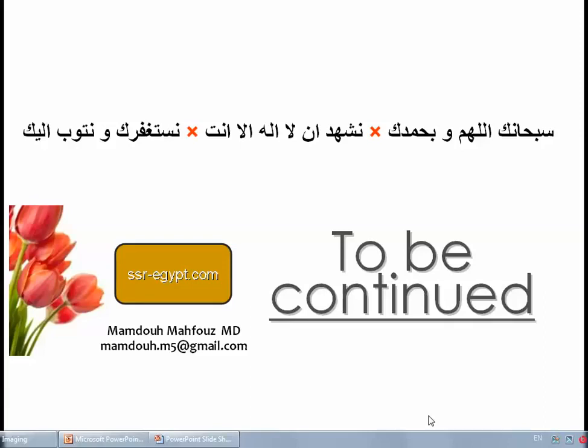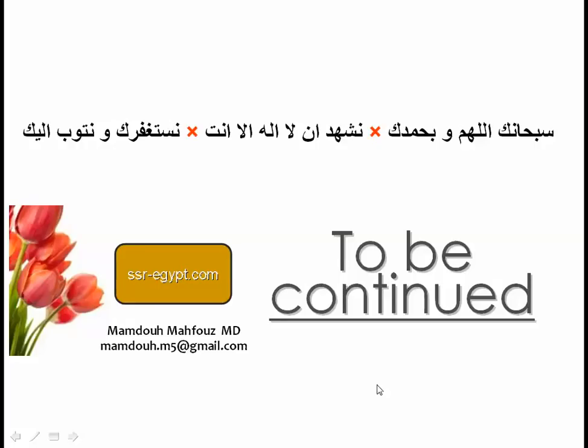Dear colleagues, now we will continue the topic of MRI or imaging MRI of the knee joint. We have started the evaluation of the knee joint, and we discussed the anatomy as well as the technical aspects and the meniscal pathology. Now we are going to continue this part discussing the ligamentous lesions.